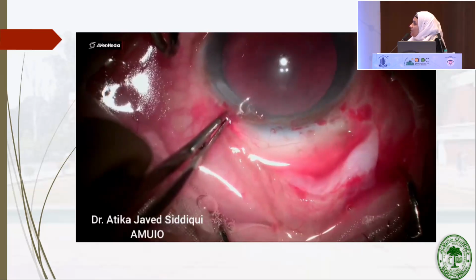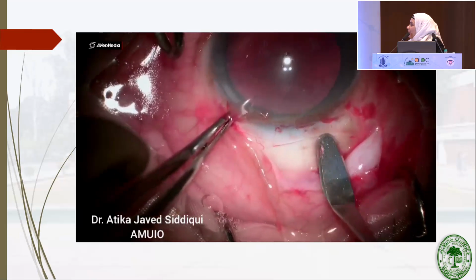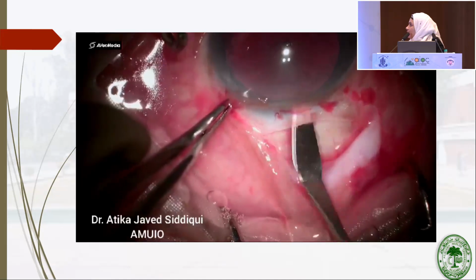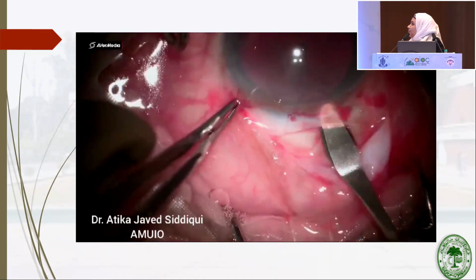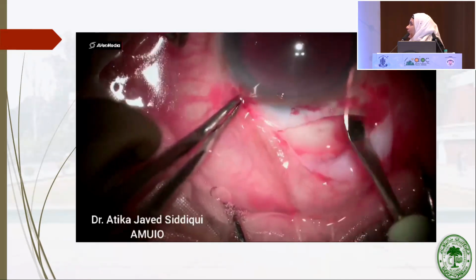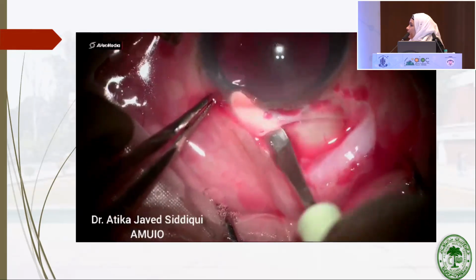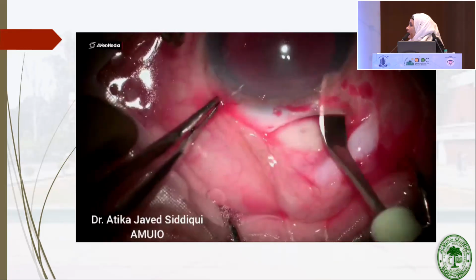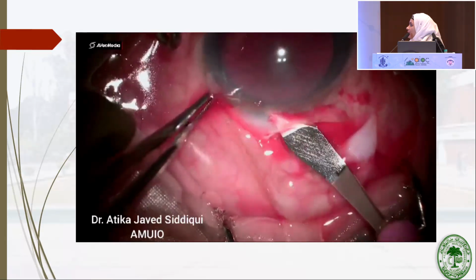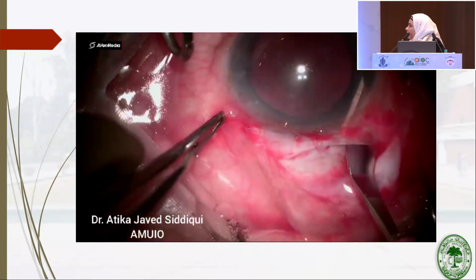Here the incision is created with the blade, and just the weight of the blade is given. With the crescent we revise it, and then we go forward with the tadpole movement and create the lamellar separation, and then we swipe sideways, the swiping movements, and create the cuts, and then we dissect the side pockets. For the internal incision, the keratome should be entered sideways, and a dimple down technique should be used, and a forward anterior cutting should be used.